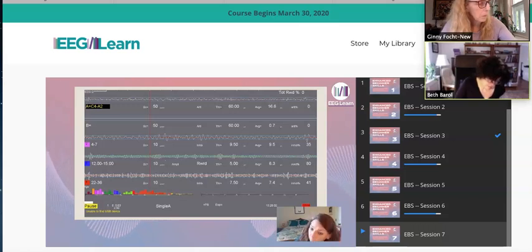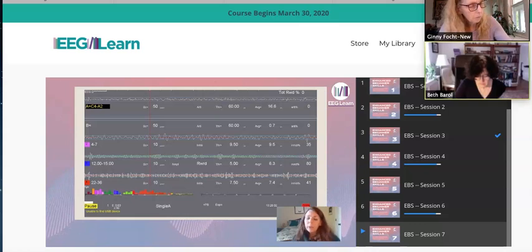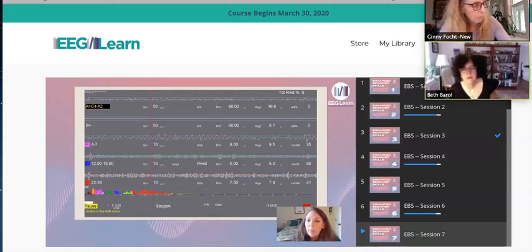However, here's where the percentages can come in handy. If we know that inhibiting the fast frequency beta at 25% is a moderate challenge level for that activity, that's what we talked about last week. Well, what we've already done is tighten up that threshold.